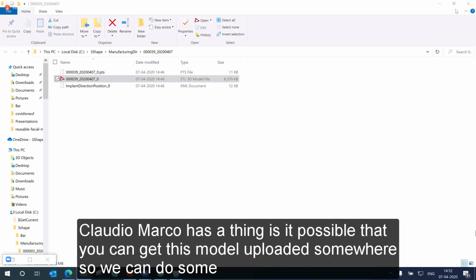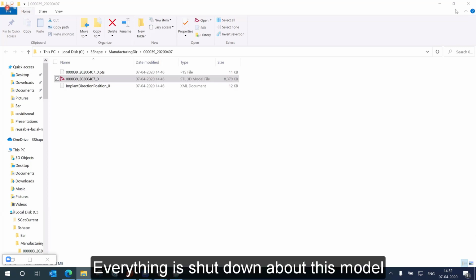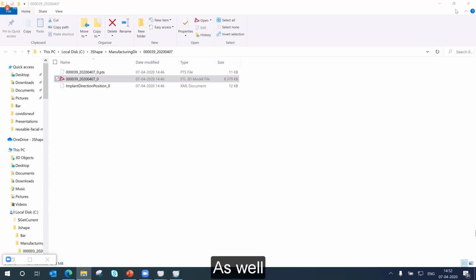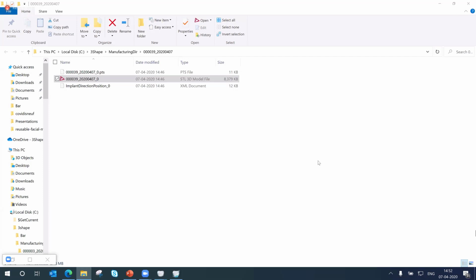Claudio Marco has asked, is it possible that we can get this model uploaded somewhere so we can do some training, since this Corona thing is going on and everything is shut down? Yes, yes, yes. Of course, I can send you this model, and I can send you some attachments as well that I have created, and you can use them. Definitely, I can upload this.